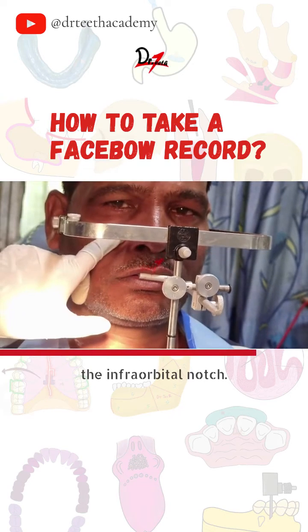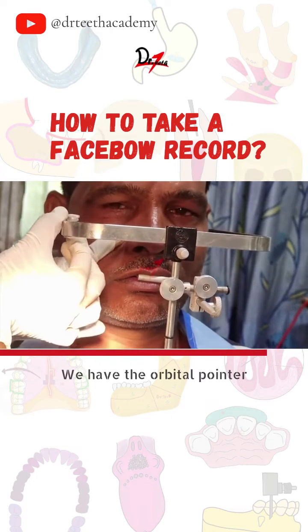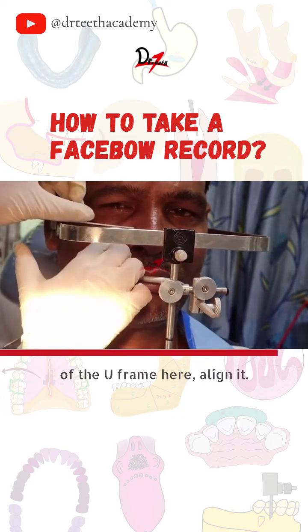Then palpate the infra-orbital notch. We have the orbital pointer of the U-frame here. Align it.